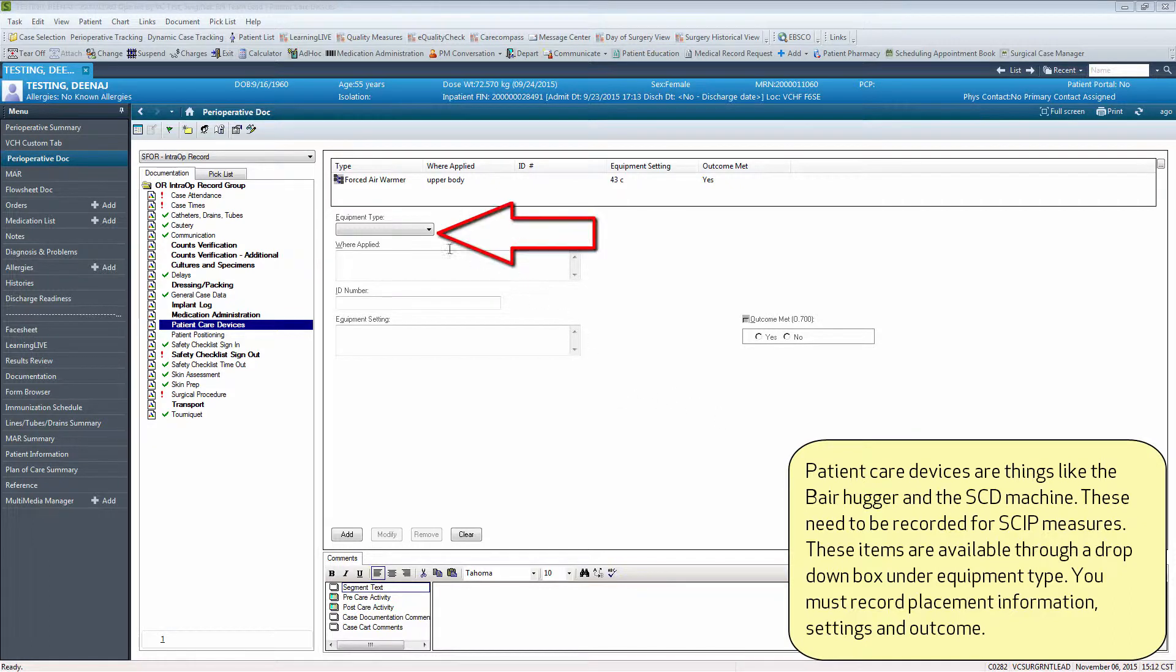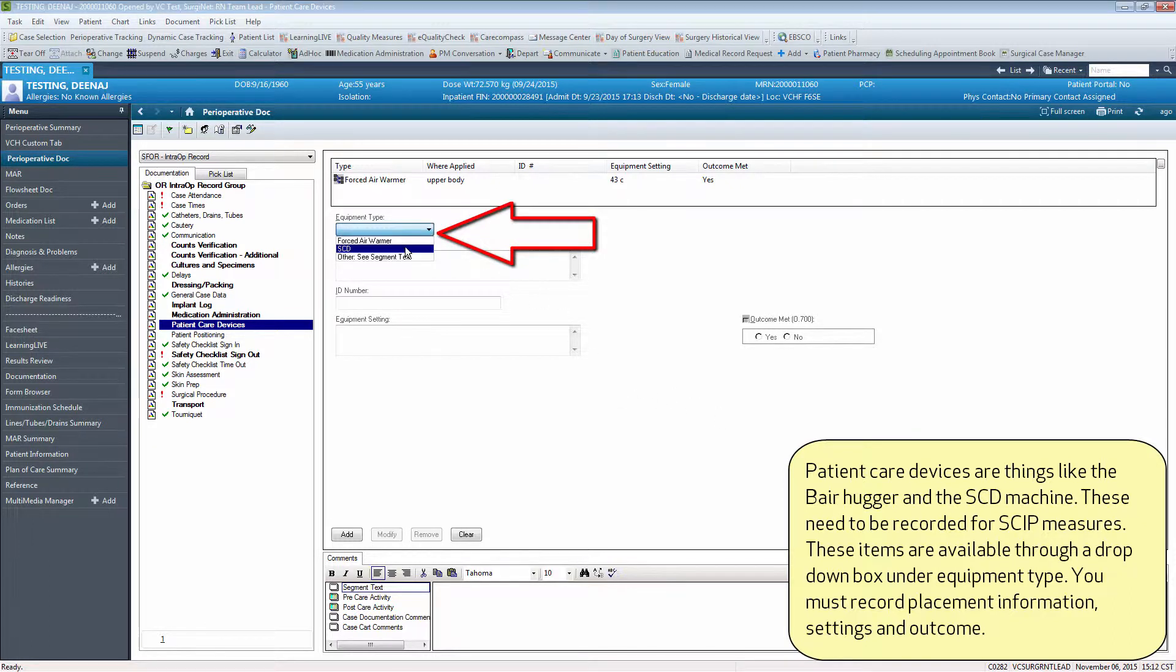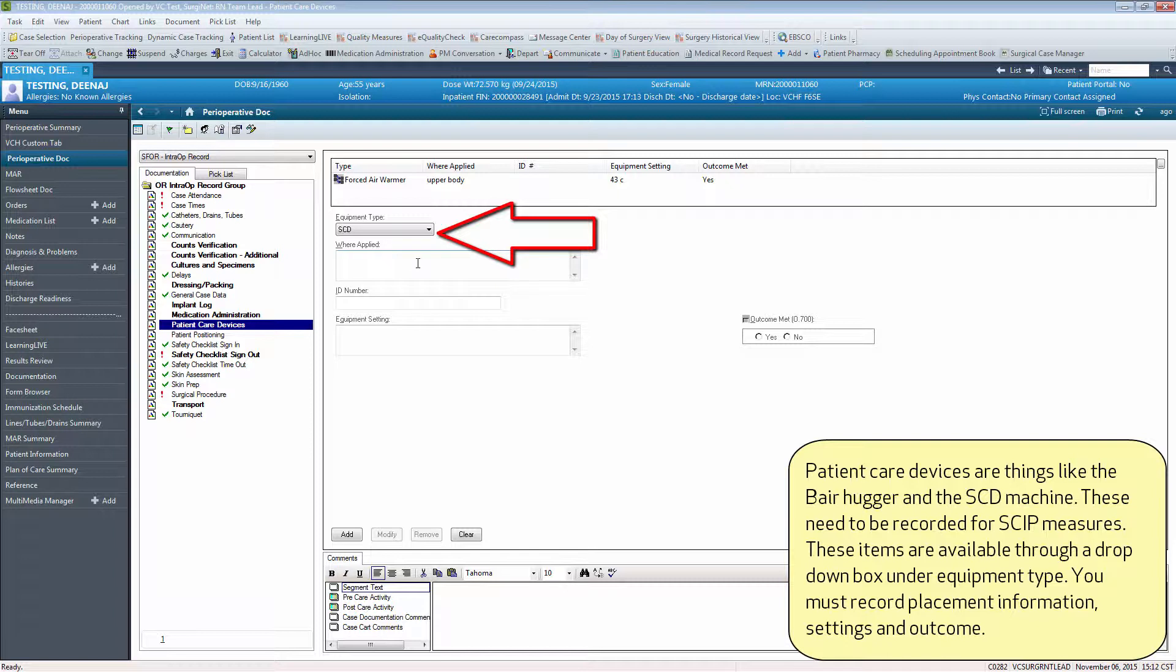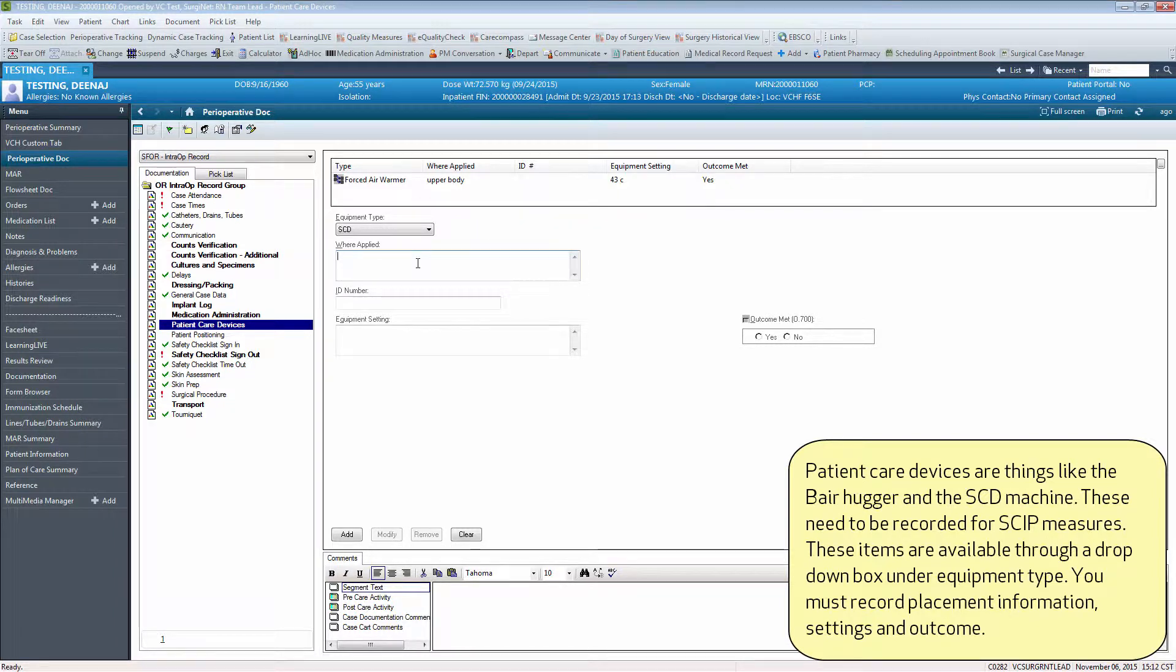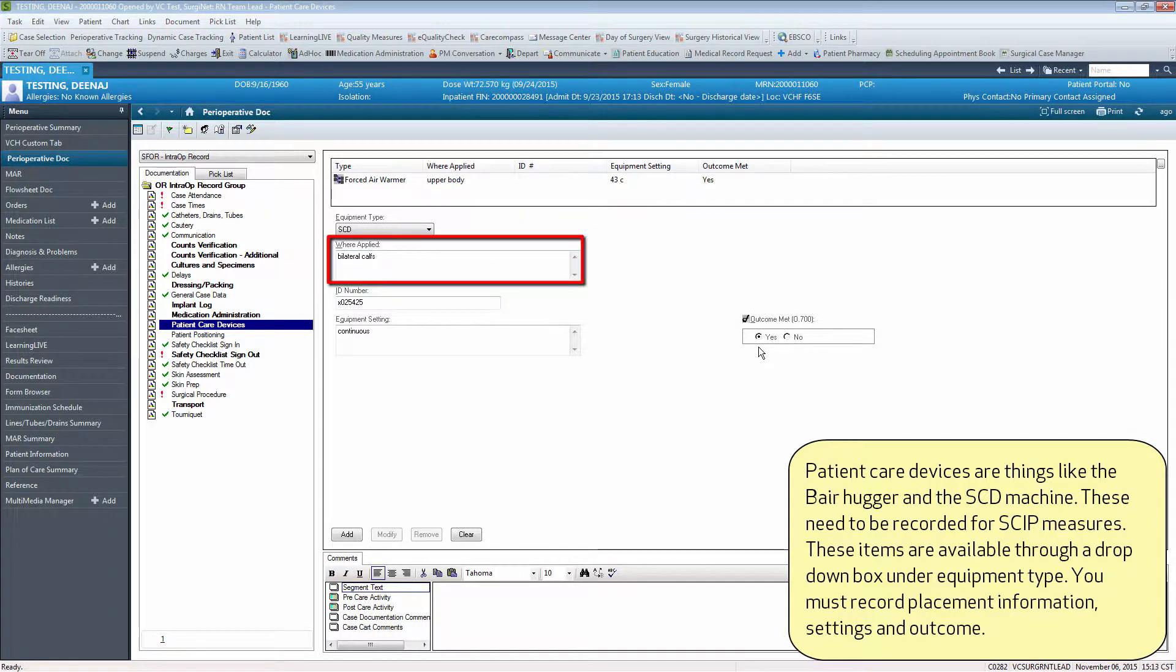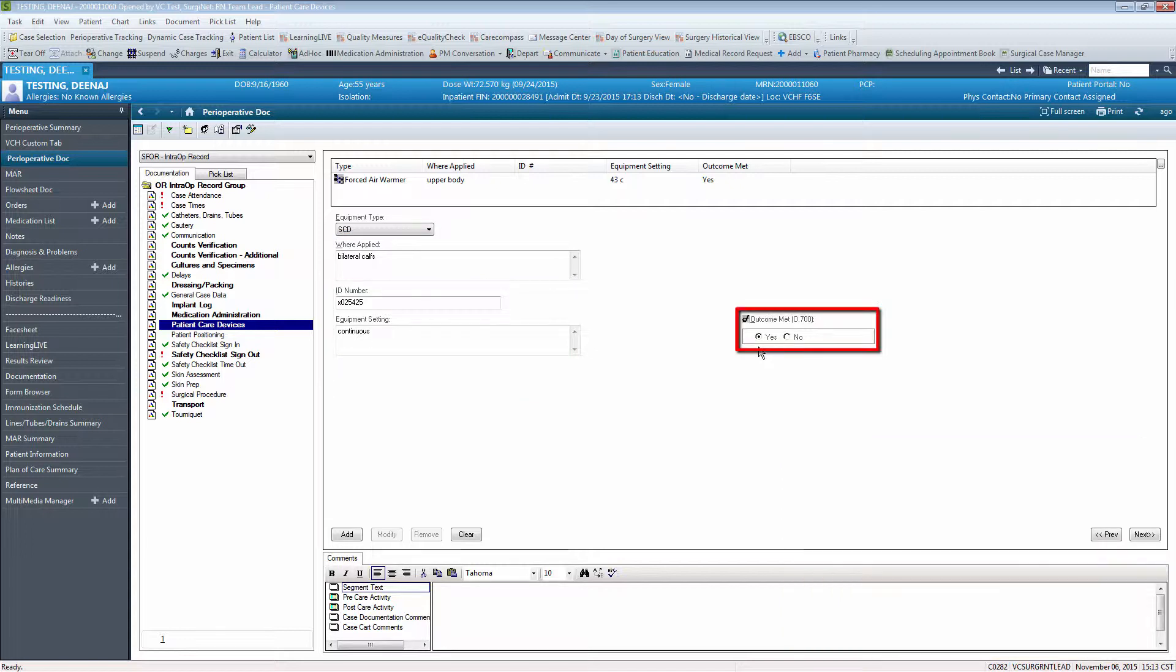These items are available through a drop-down box under equipment type. You must record placement information, settings, and outcome.